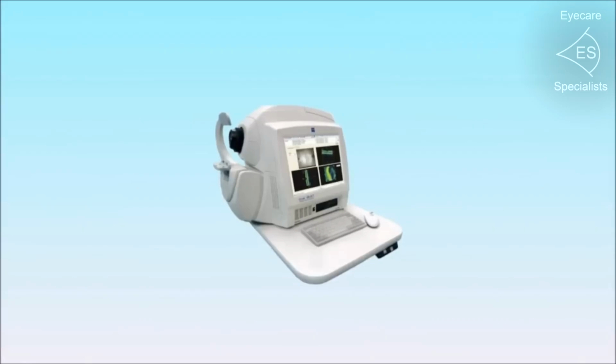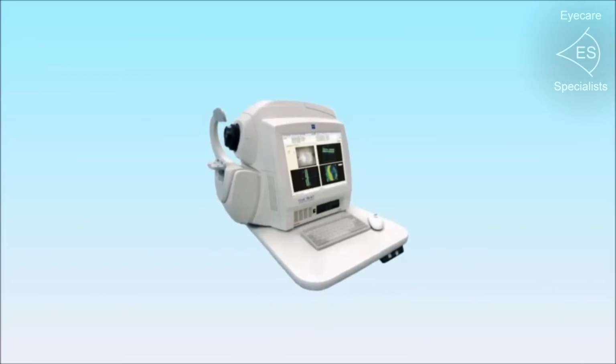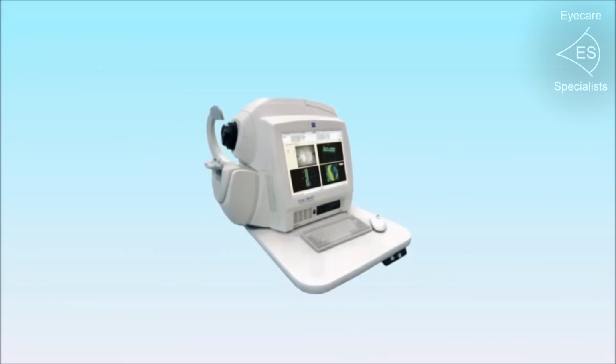We believe that all patients over 60 years of age and those in high-risk groups should have an OCT scan regularly, at least every 2 years.